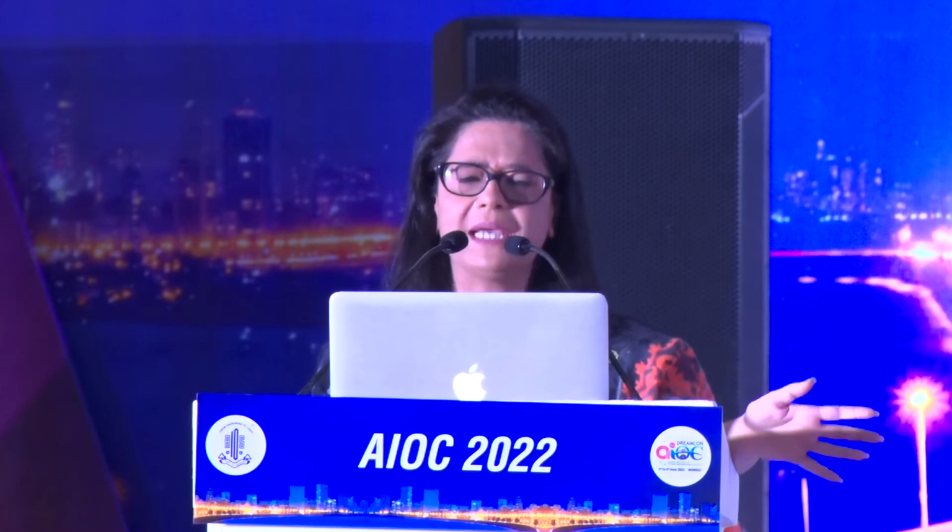Since we are doing this session for general ophthalmologists who are transitioning to cataract refractive surgery, it's very important to choose the initial cases. You don't want to have a bad, unsatisfied patient and then get disheartened and not do more of these lenses. So choose a hyperope presbyope. These are extremely grateful people because they've already been struggling with their plus for near. Whatever comes out, even if there's a small residual error, they're extremely happy patients.